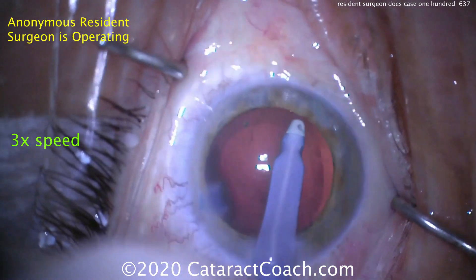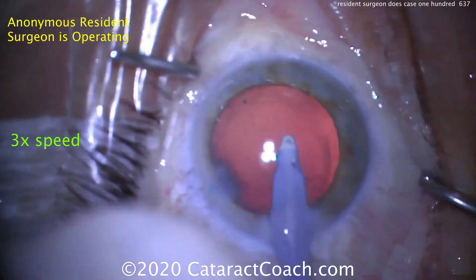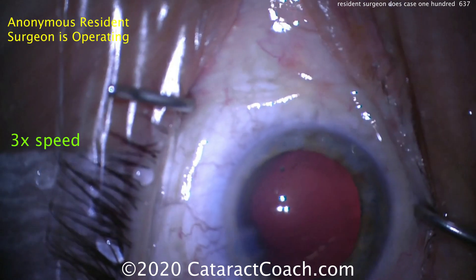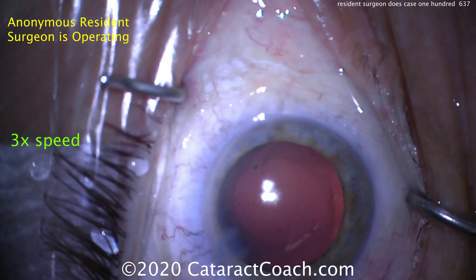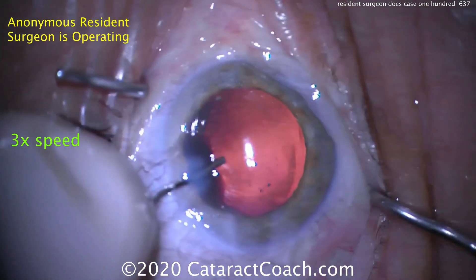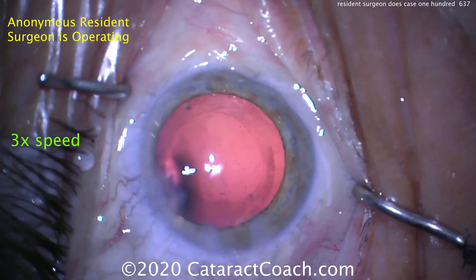Now, should you polish the anterior capsule rim? You certainly can, and this resident is doing a good job of that. If you're a resident who's done less than a thousand cases, no one's going to fault you for doing less than 100% capsule polishing. Because in truth, we've seen many studies that show it really has minimal benefit in terms of developing posterior capsule opacity.